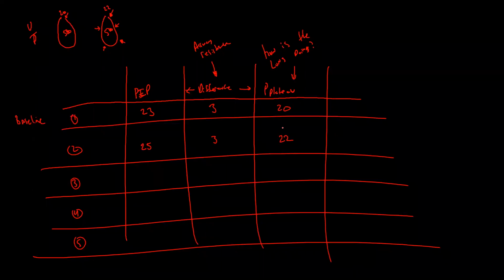So, Tamisha, what Denise did is she looked at this plateau pressure, and this is literally the thinking that I do on the test. I'm looking at the plateau pressure first, and I'm comparing the two. Okay, this plateau pressure has increased. The volume is staying the same in these examples. And so if it's taking more pressure to keep that volume in the lungs, that means the lungs are getting stiffer, which means the patient's getting sicker.